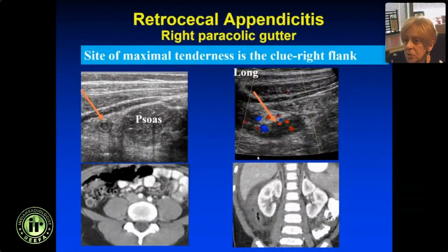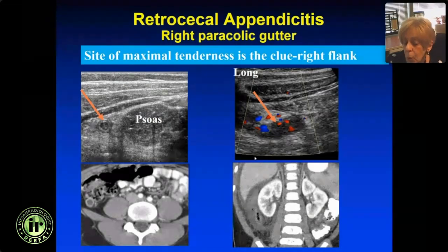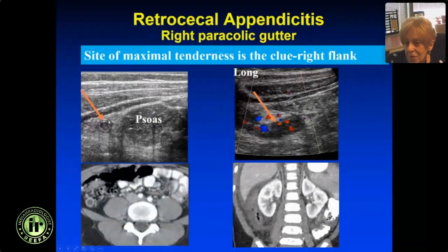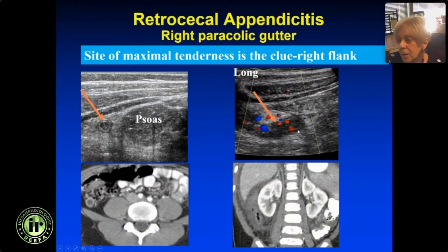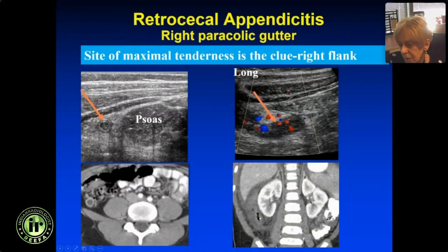Occasionally the appendix is in the right paracolic gutter — retrocecal. That's why we always ask at the start of the exam: point with one finger, where do you hurt? If they point to the flank, look in the flank. Here's the psoas and here's the appendix; normally it would be in front of the vessels, medial to the psoas, but this one is retrocecal. Here's the CT for correlation. Here's another case where the patient pointed to mid-right flank — this is the appendix with inflamed omentum retrocecal.